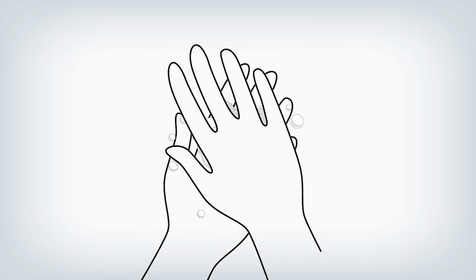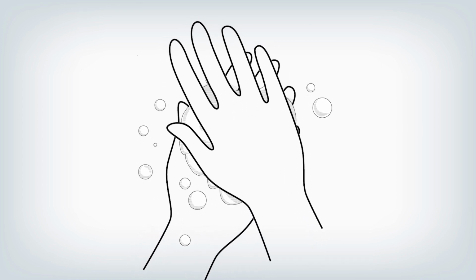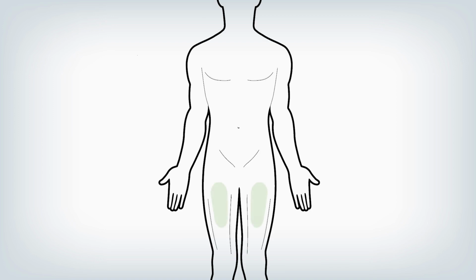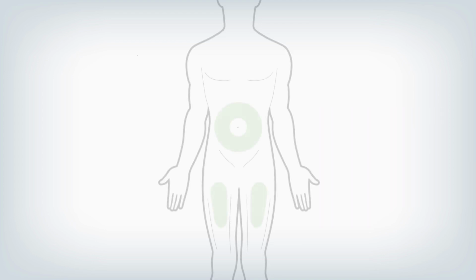Before self-injecting, wash your hands thoroughly with soap and warm water and dry with a clean towel. The recommended sites to inject are the front of your thigh or your abdomen, your stomach area, except for a 5 cm or 2 inch area around your navel or belly button. The outer area of the upper arms may also be used if the injection is given by a caregiver. Do not attempt to use the upper arm area by yourself.